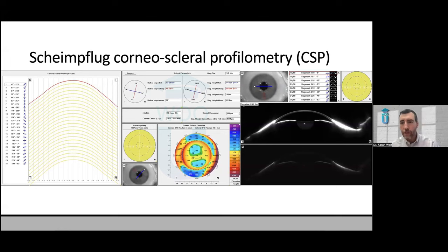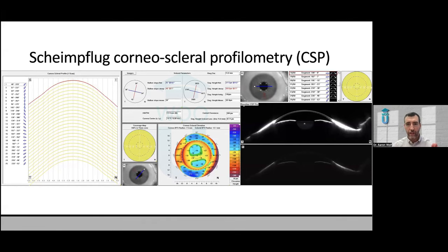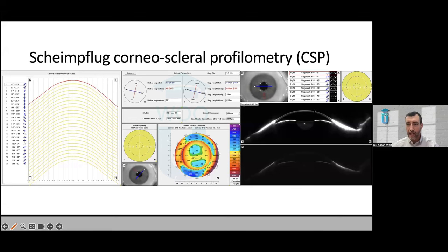This technology can now scan out to the sclera. The colorful elevation map shows blues and oranges or reds — warmer colors are higher, cooler colors are lower. With this instrument you can either stitch together about five different views or take it all in one; I'm always a proponent of a single capture. The Scheimpflug OCT images show the brighter scan capturing the cornea and the dimmer one capturing the sclera.